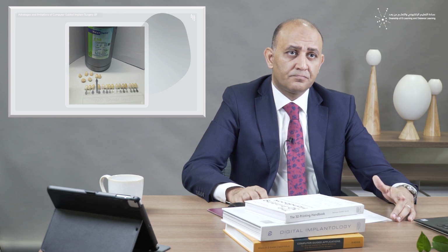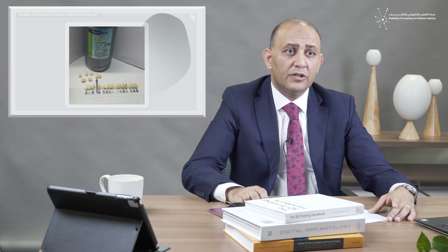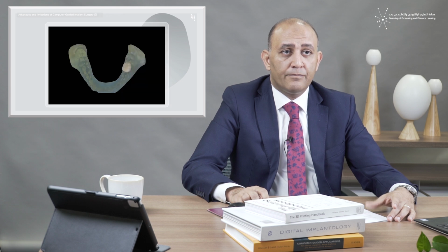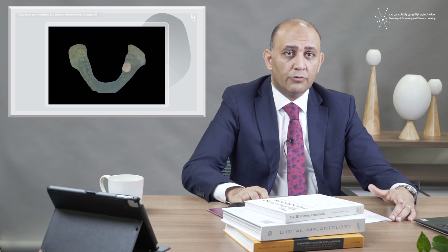It provides different shades, and in this case we use shade A3.5. So the temporary crown has been actually printed. When we came to the surgery, we had the crown in advance.